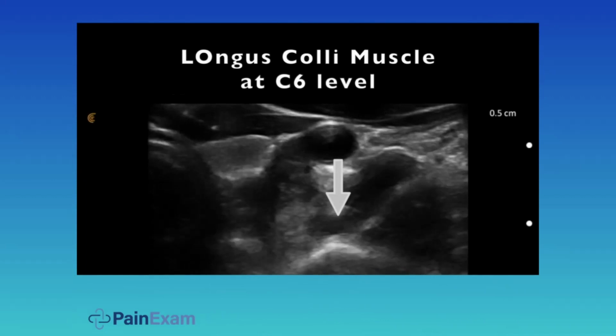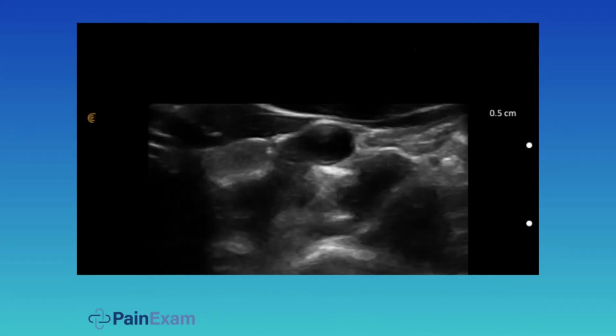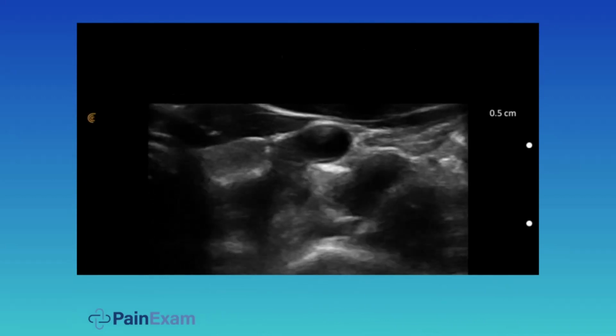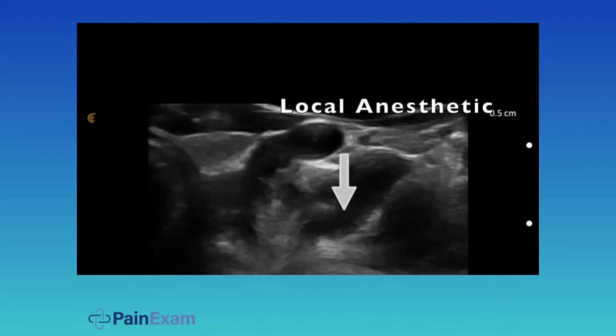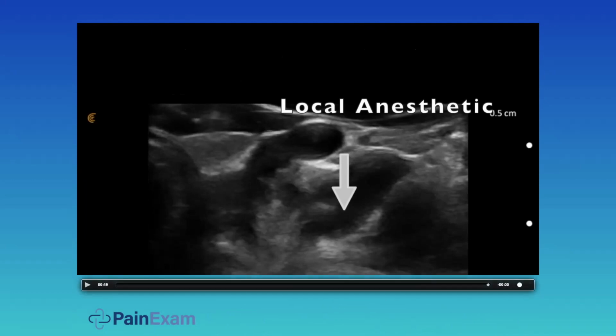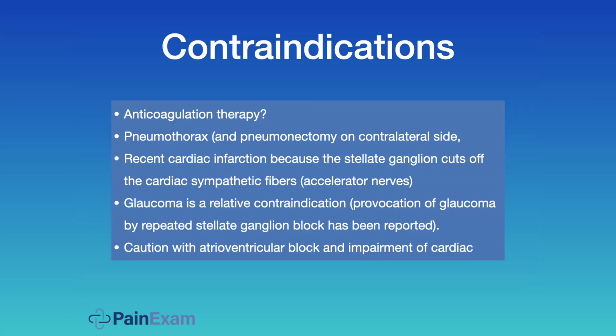Here's with a different ultrasound probe, a newer one. I'm transthyroid in this approach. And I'm giving the local. Sometimes with the patient breathing, it changes the screen, so you sometimes have to get in there quickly and carefully, with care not to puncture the carotid. And that's one reason why you probably don't want to do this on a patient who's anticoagulated.